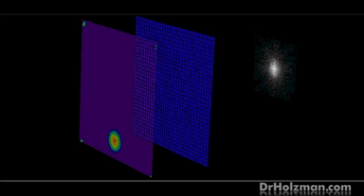You use dynamite to start the process. So the larger treatment zones, and then it's going to get smaller and smaller. And you see the lasers going smaller and smaller, and that's kind of like the finer chisel for the detail of the treatment. And at the end, you can see the point of light. And all of that is driven by the laser and mapping systems that we've taken in advance of the procedure. Okay? So that's what a custom treatment looks like.